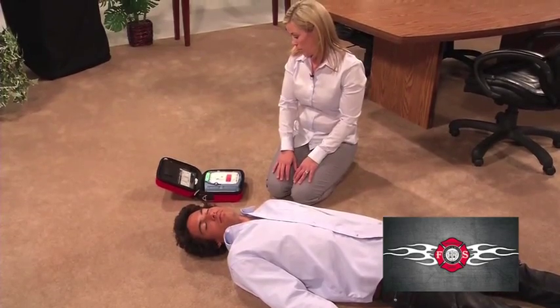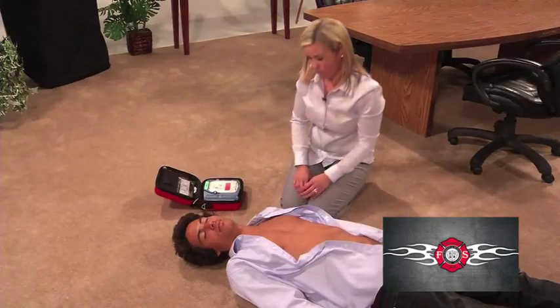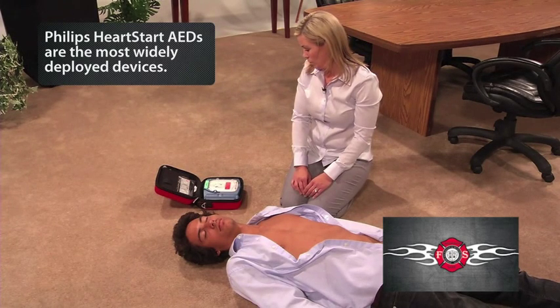Begin by removing all clothing from the patient's chest. Cut clothing if needed. You have already called 911, so remove the clothing from the patient's chest as quickly as possible.